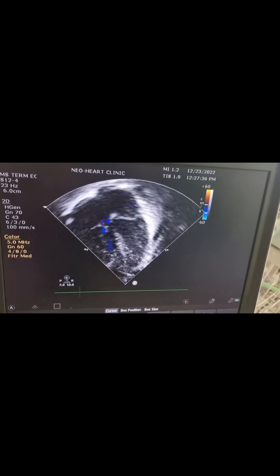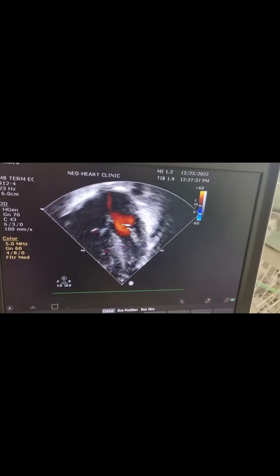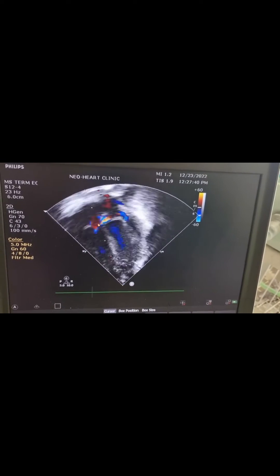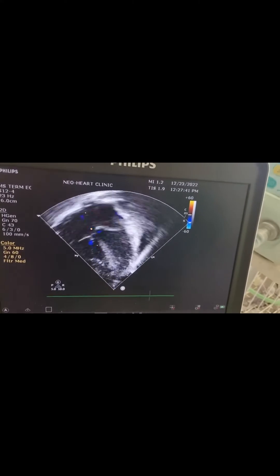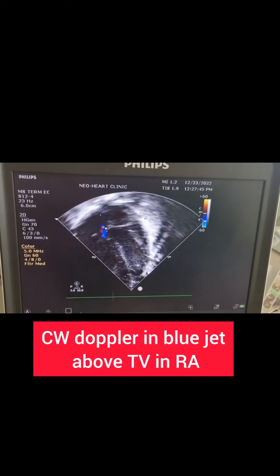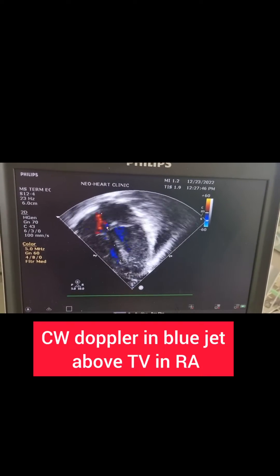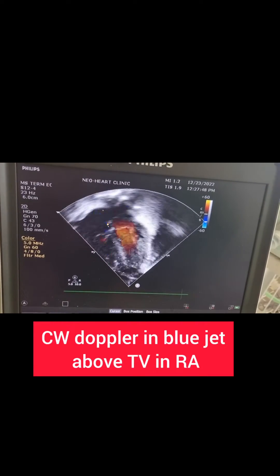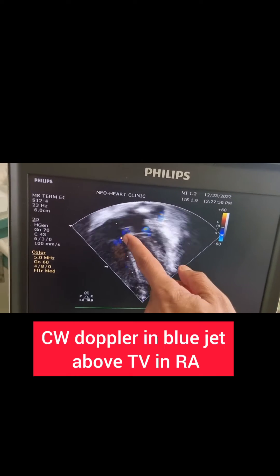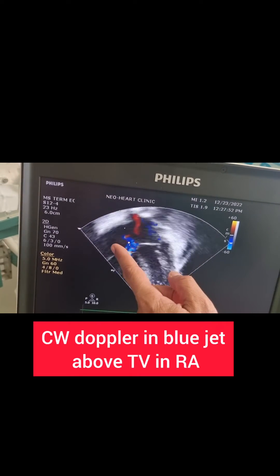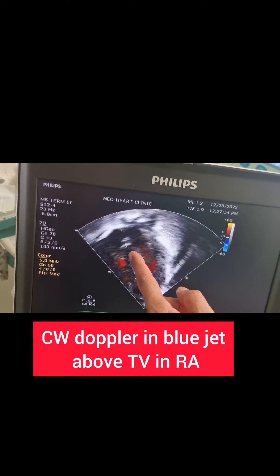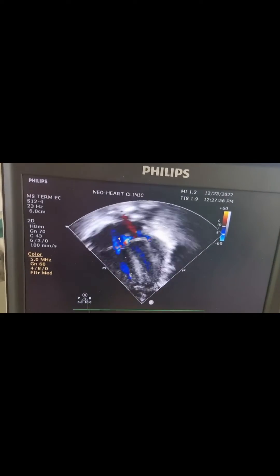If we have to measure the TR jet, the cursor — the yellow dot you are seeing — has to be placed in the blue jet, that is the regurgitant jet, towards the RA side, the atrial side, just above the tricuspid valve.